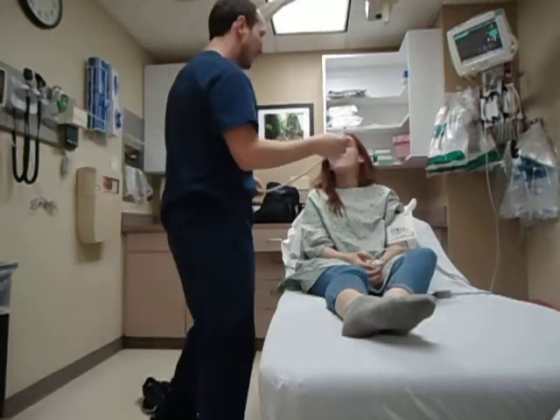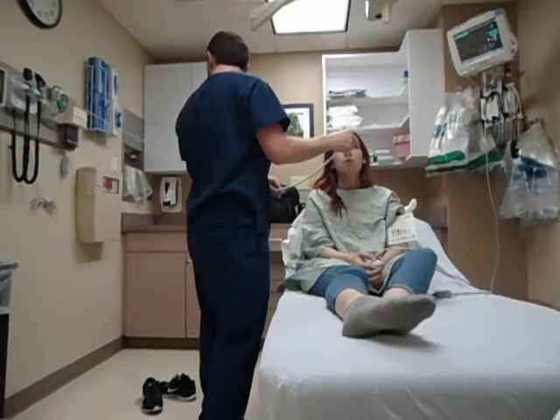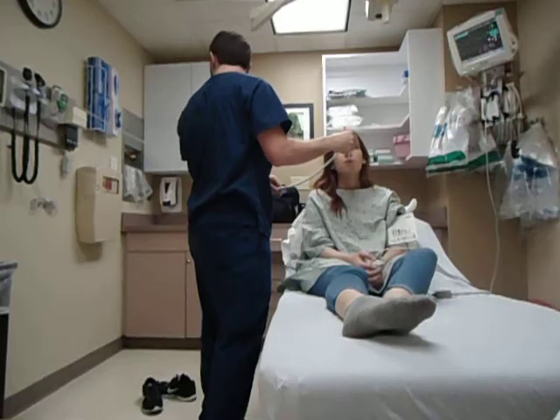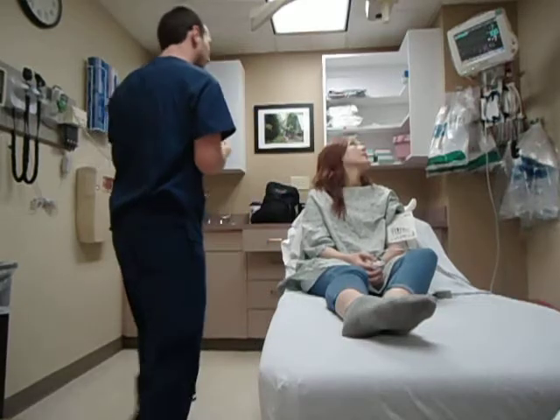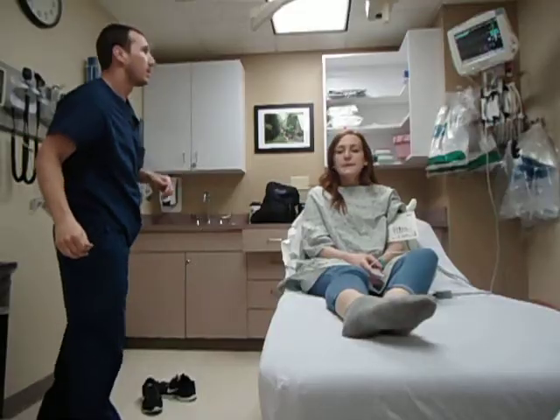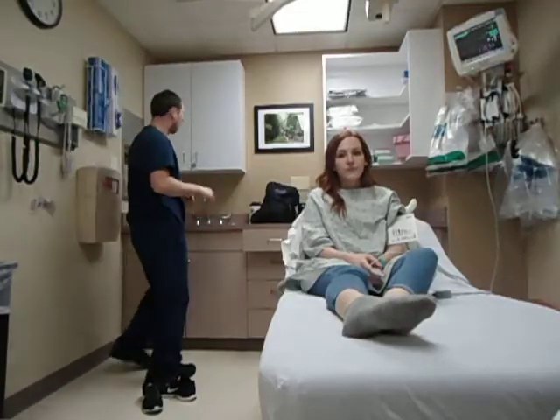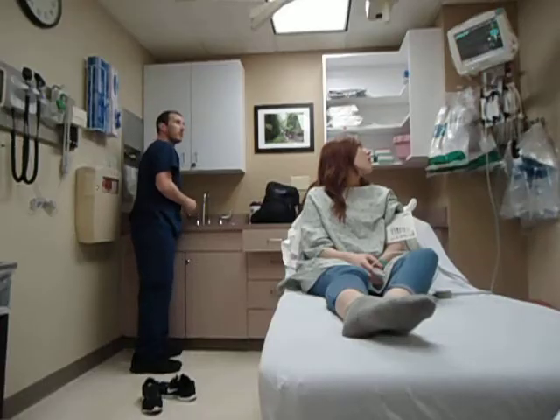I'll go ahead and get my patient's temperature here. .7, and then I just washed my hands before this video started taking place, but I'm going to go ahead and wash them one more time.